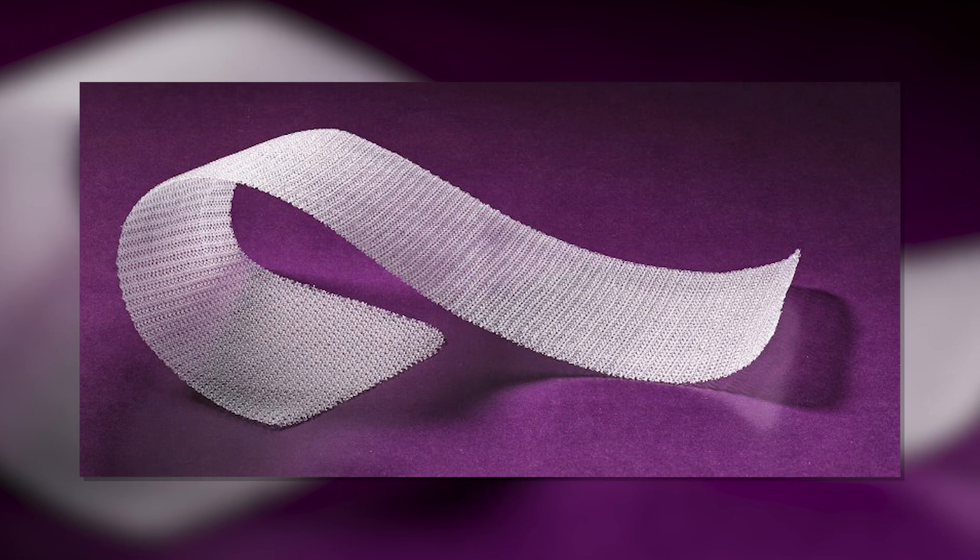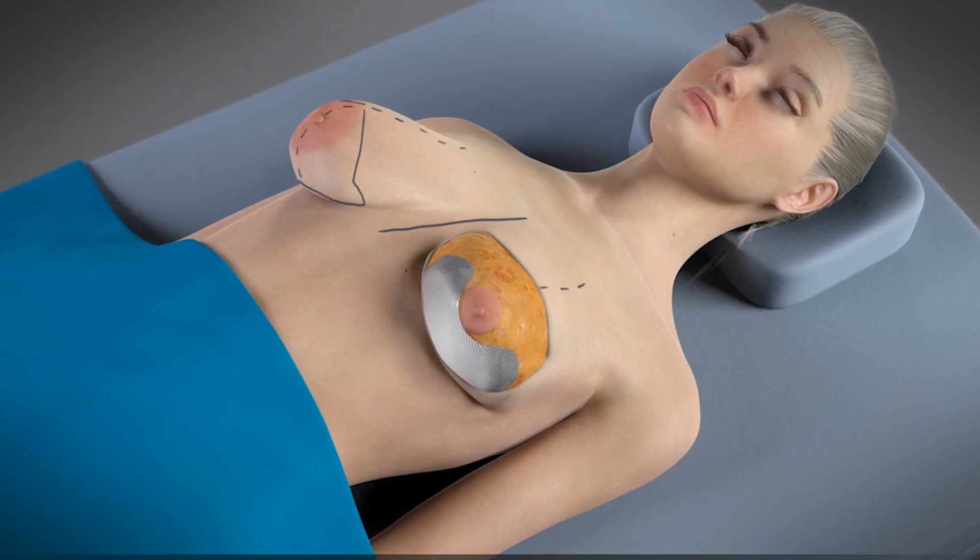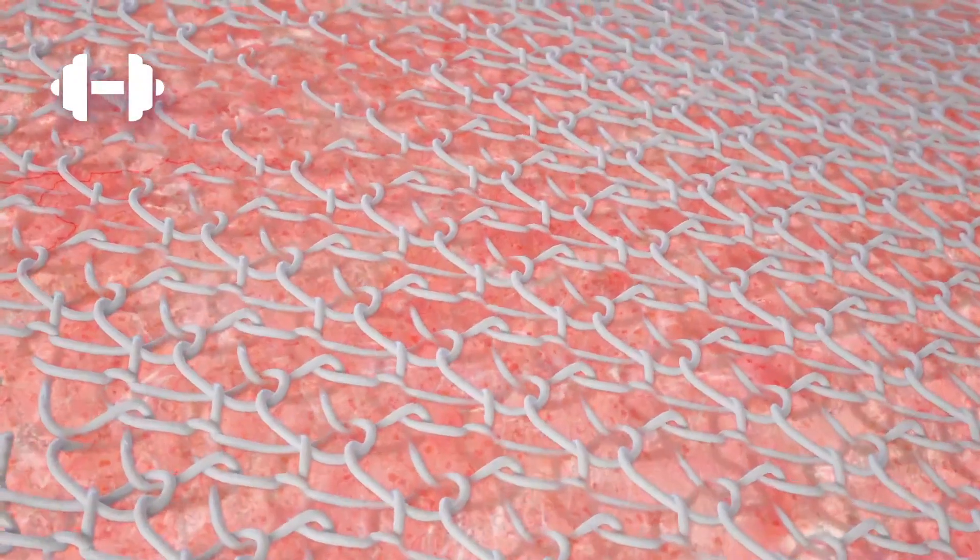Galaflex, the original version, is an internal support mesh or scaffold that we're using to provide soft tissue support. This has been a game-changer. This is an absorbable mesh, so we put it in the body. We're actually tricking the body into doing what it does naturally — it sees this as a foreign material, it encases it, isolates the intruder, with collagen and scar tissue.